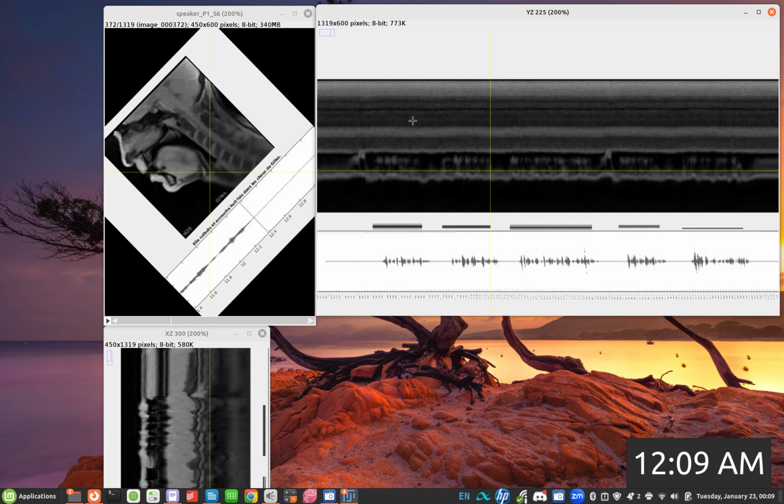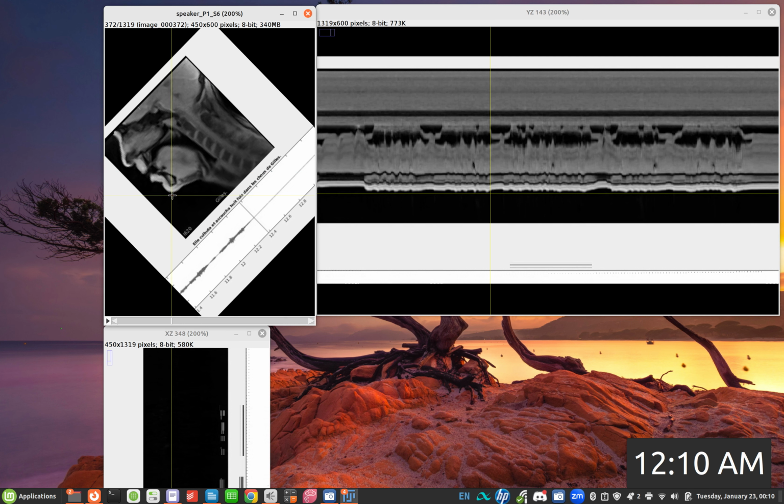Now to draw the kymograph, to have the kymograph for the path of the velum's movement, what we need to do is move this vertical line in the image, inside the image stack, to the appropriate place. So it should be around here, like yeah, around here.